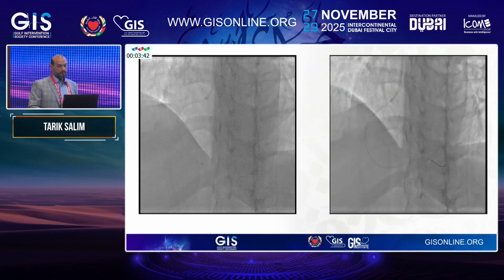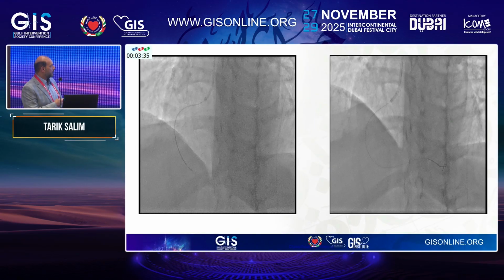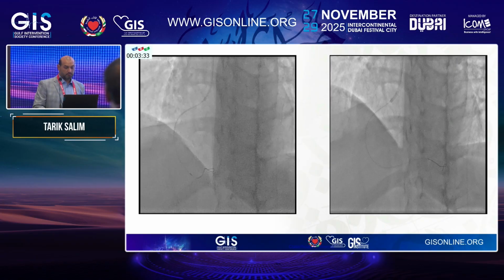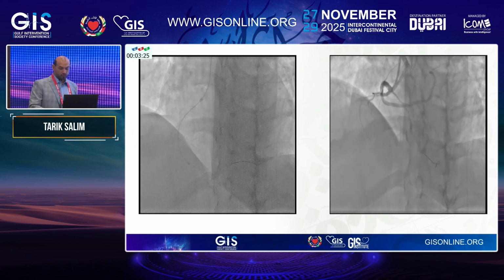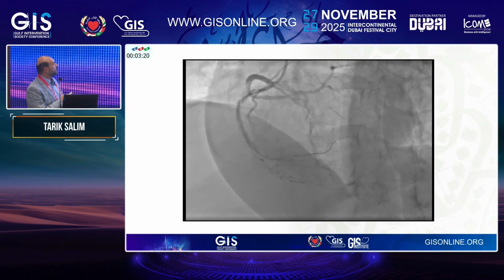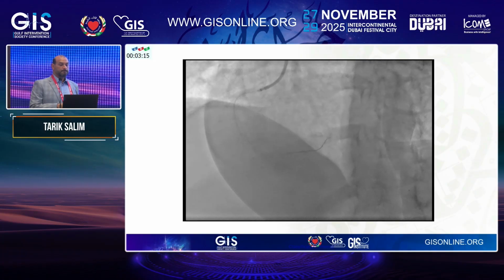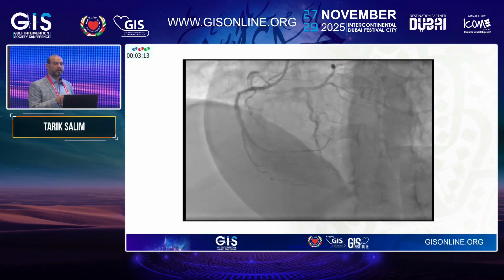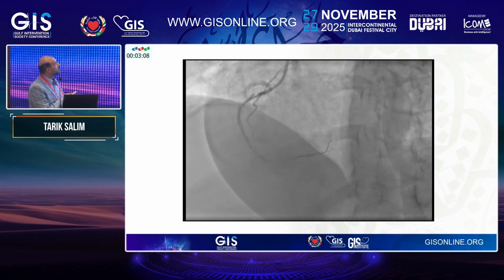And then I took my microcatheter down, and I exchanged to a normal Sion Blue angioplasty wire. And then the fun started. So lesion preparation took me to this. I'll tell you what I used to get to this stage, which is slightly scary, to be honest. When I saw this, I was a bit scared. I needed to protect the ostial and the left main, obviously, which is coming just around here.